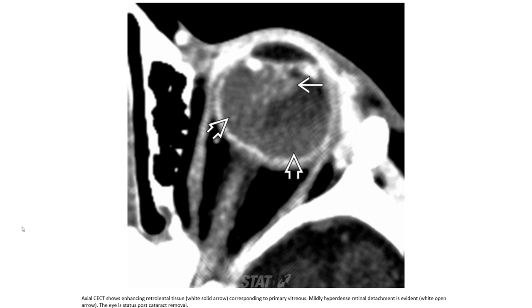This is PHPV on contrast-enhanced CT. Enhancing retrolental tissue corresponding to the primary vitreous is demonstrated. The hyperdense vitreous body is noted, with density higher than the normal vitreous.